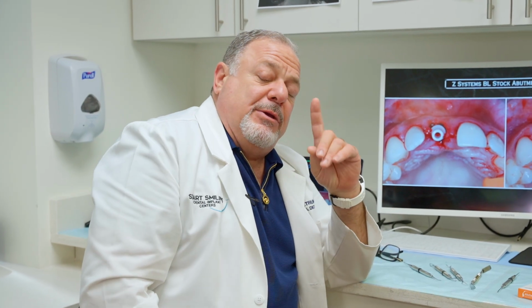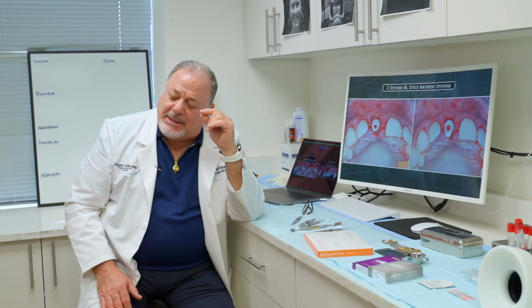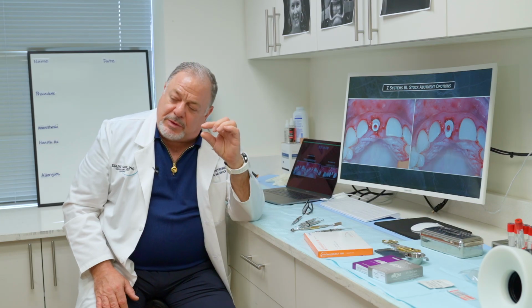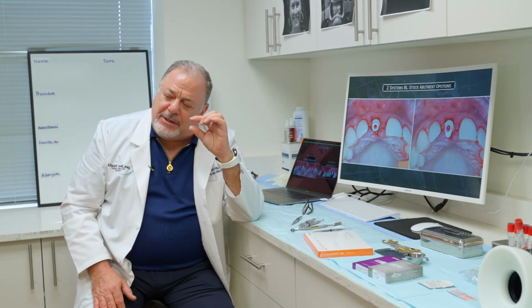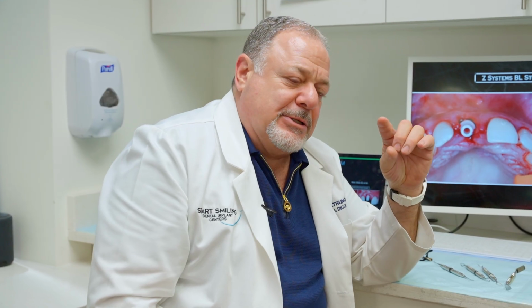Now, it is very unique to understand, and I say it in lectures all the time. The other thing about zirconia implants is that when you're putting a titanium implant next to a natural tooth, it's very critical how deep you put that implant in the bone, to avoid either creating more bone loss around the tooth or a big circumferential type moat around the implant itself. When you place the zirconia implant next to a tooth and go deeper, you don't see that happening.